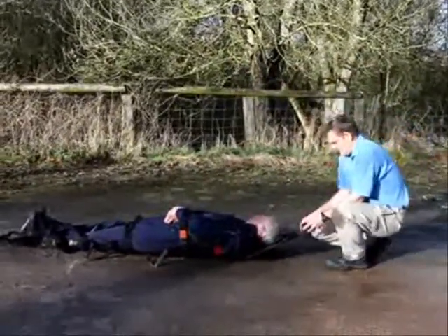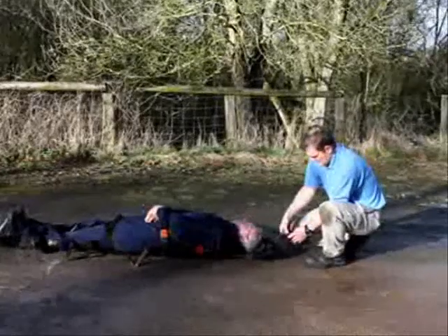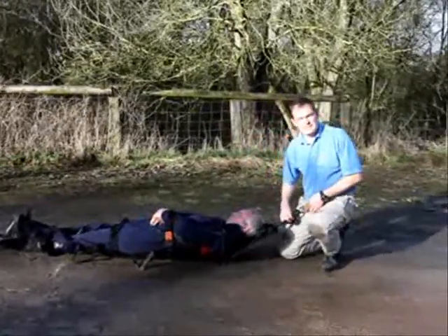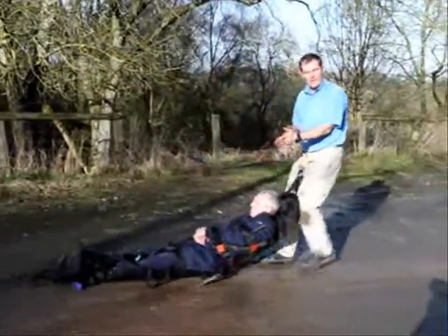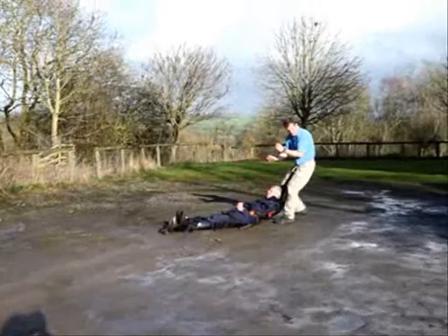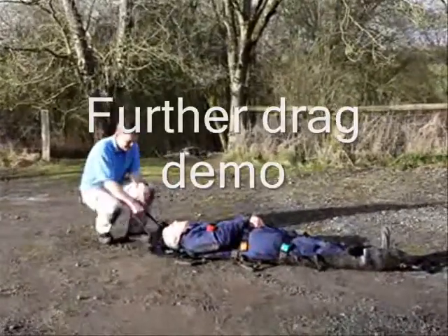The straps at the top and bottom also have loops that we can attach a carabiner through. So if you're used to wearing a rigger belt, you can potentially clip it into the belt, freeing your hands, and potentially you can either have a weapon or a ballistic shield to cover the casualty and the rescuer as well. So now the patient's more secure and we're ready to move again.